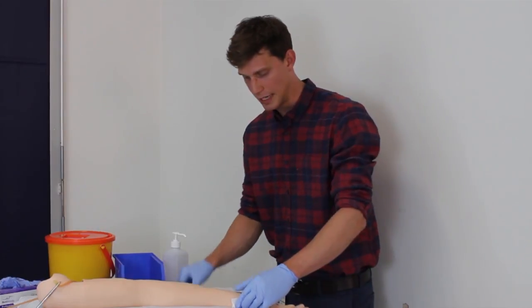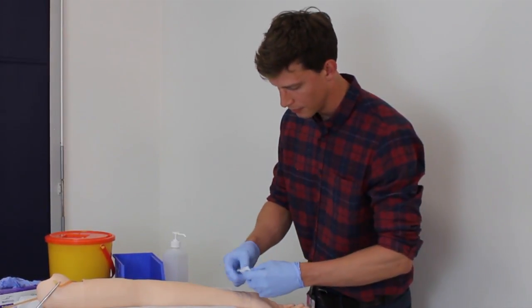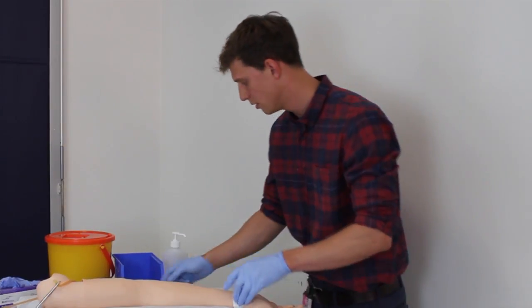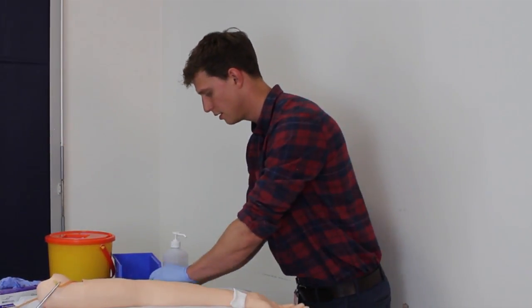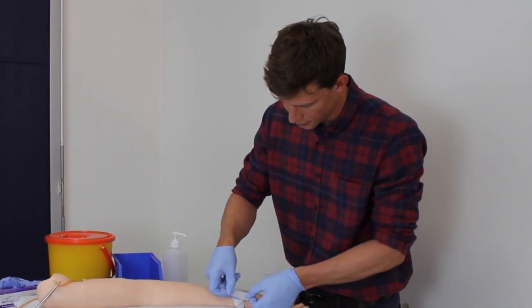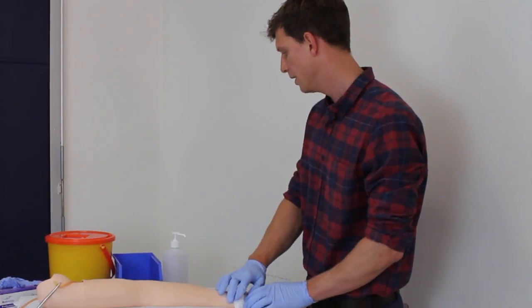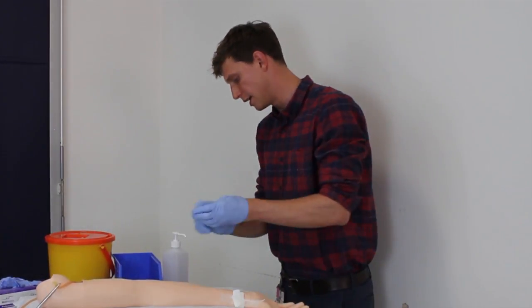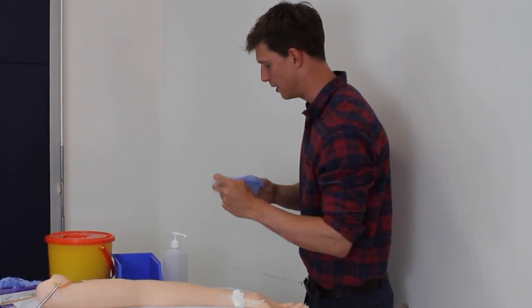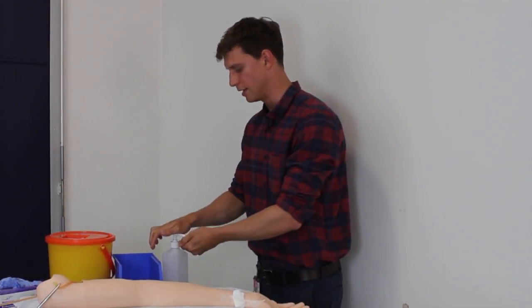I change my swab to a fresh swab and stick it down to make sure it's anchored in place, making sure the patient is comfortable and happy. I then discard the rest of my equipment and wash my hands again before moving on.